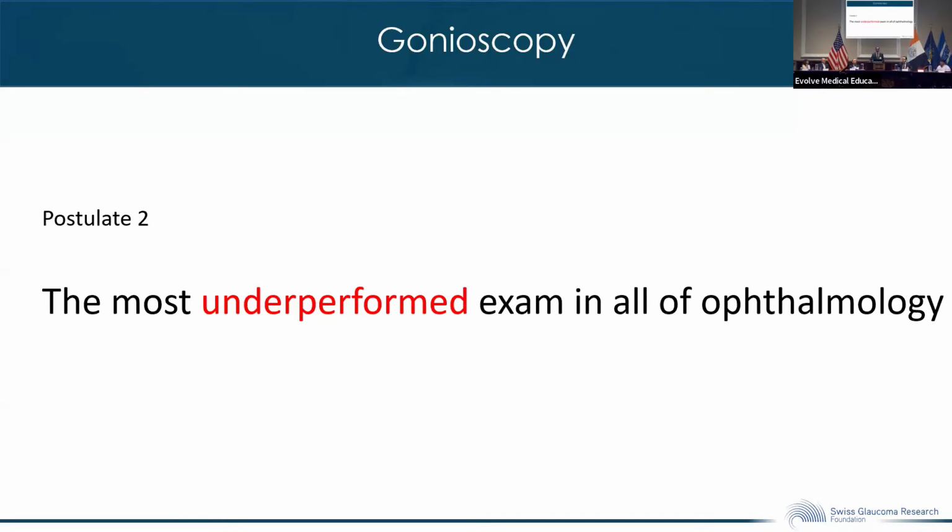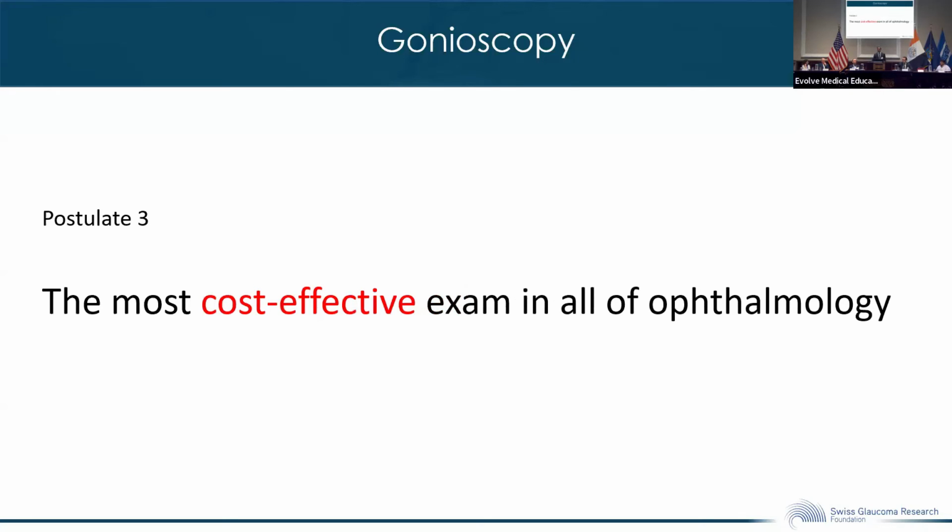The second, and unfortunately related to the first, is that it is probably the most underperformed examination in ophthalmology. I believe every patient should have gonioscopy, not only every glaucoma patient, but that's not reality. All it takes is a single lens, which if you take good care of it lasts a whole career, and the slit lamp that you already have. It's probably the most cost-effective exam in ophthalmology as well.